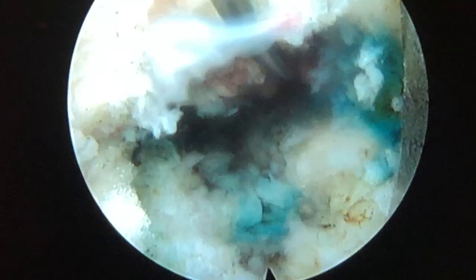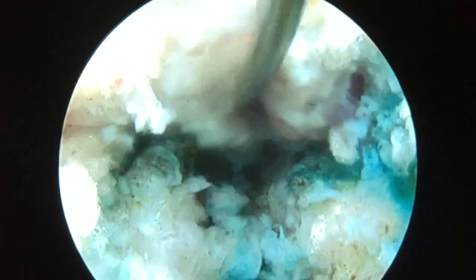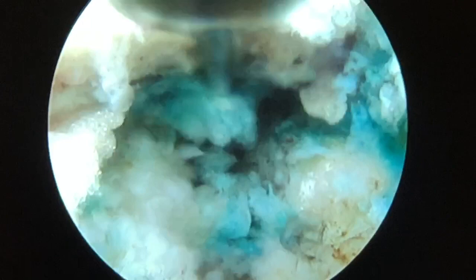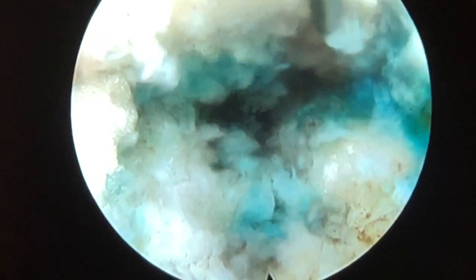When I first got in here I could not pass this cannula into the canal; now I can get it in there easily. There's a little bump right there but I can move it all back and forth. That also tells me the nerve is free, because whenever you have a disc bulge or annular tear and the body tries to repair it through the inflammatory process, it will stick the nerve down. X-ray — yes, going right around the pedicle, exactly as expected.